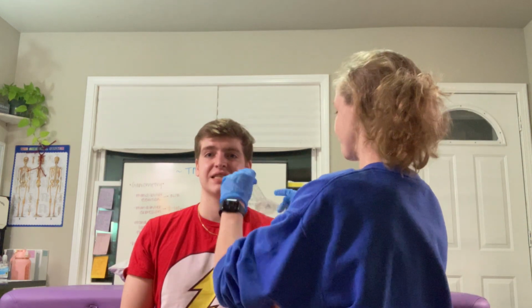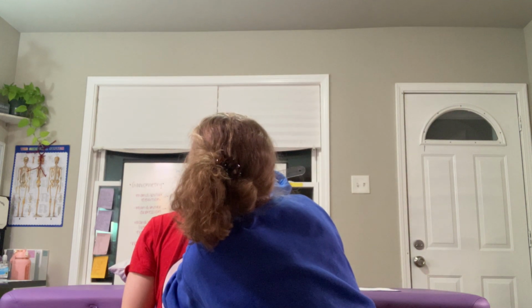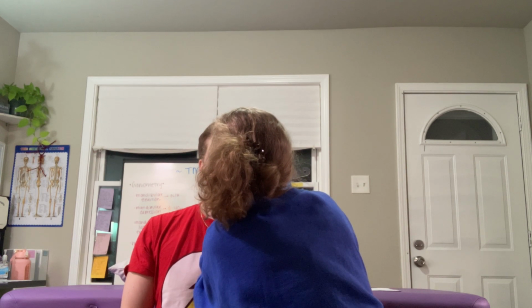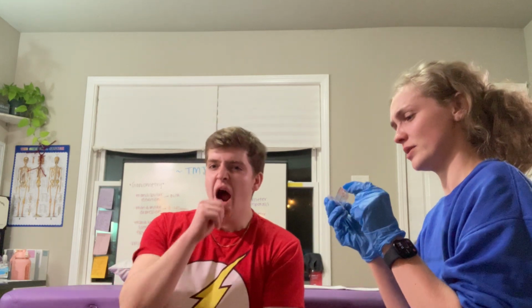So, alright. Whenever you're ready, you're going to go to the right. There we go. Oh, no, go back. Go back really quick, and we're going to go to the left. There we go. Our patient here has about 12 millimeters of lateral jaw excursion to the left-hand side, and now we are going to measure the right-hand side.